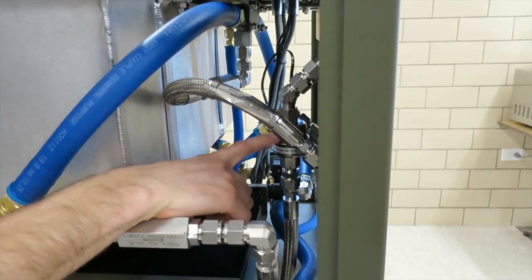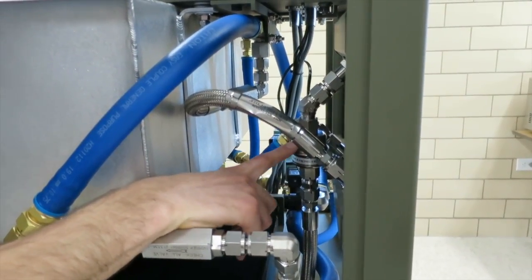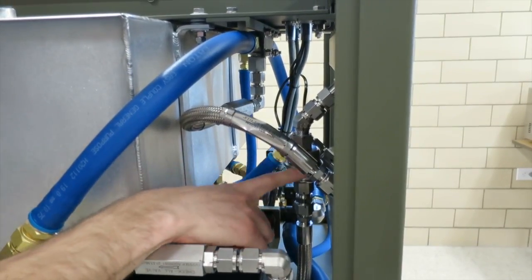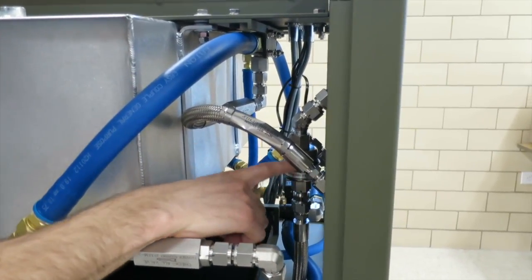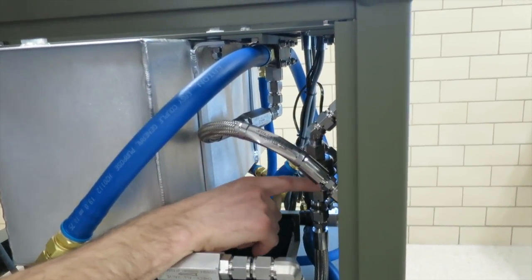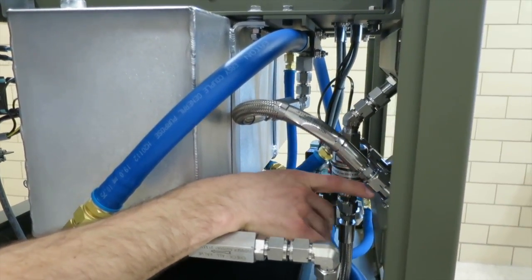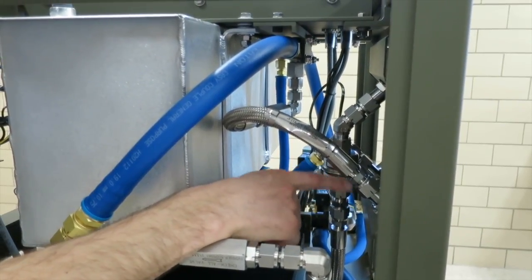So the steam trap is very important to the operation. If it doesn't close off, you won't hold pressure, and you'd probably hear some popcorn, pretty loud noises as the steam blows through directly into the tank. Not going to damage anything, but you would know that the steam trap is hanging open. Sometimes particles can blow through and hold it open, or it can fail altogether. The steam traps typically run to failure, so it should run for a long time, but if it does fail, we're going to show you how to replace it.